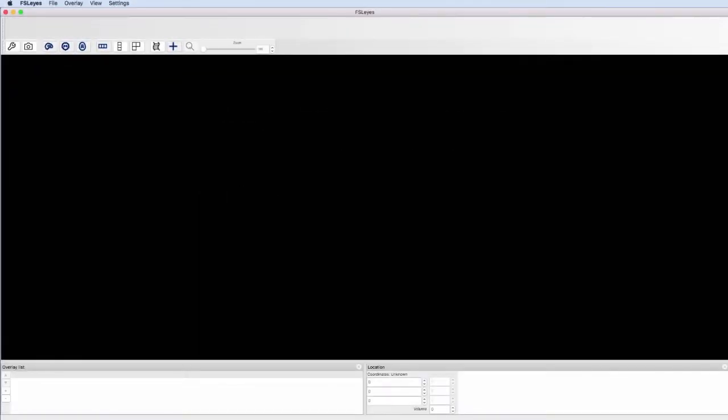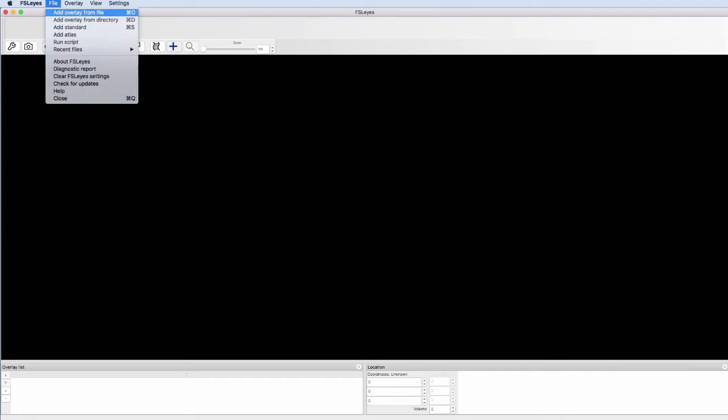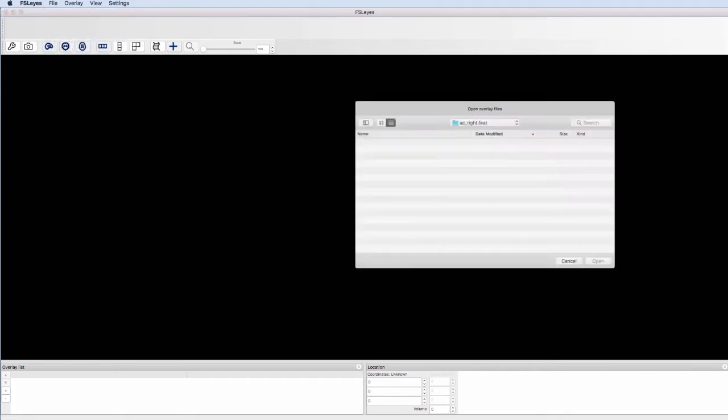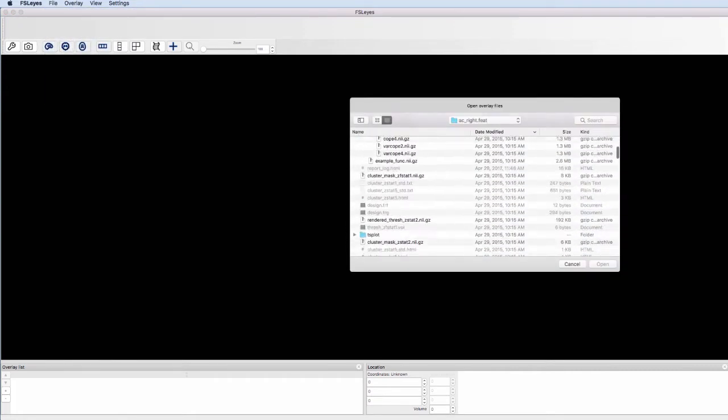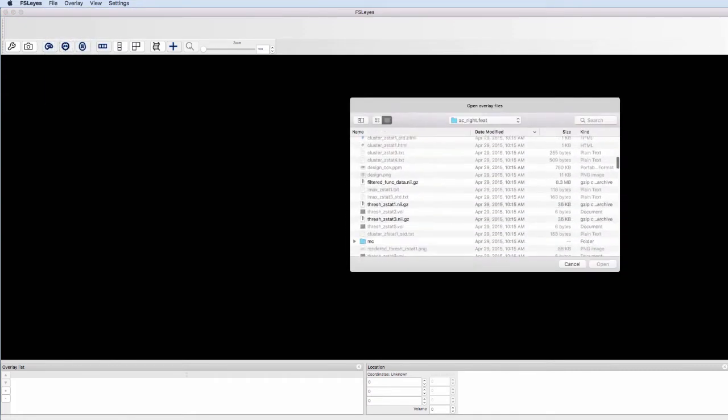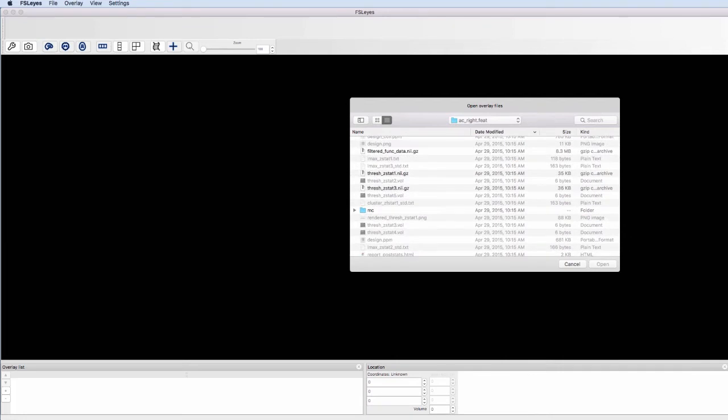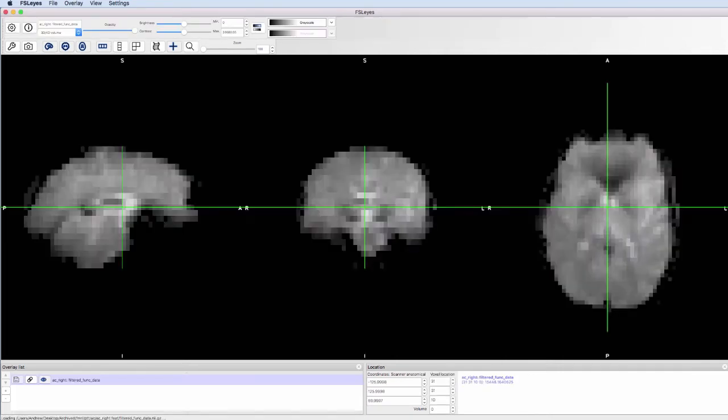You can open up FSL Eyes by typing FSL Eyes at the command line. For this demonstration, we'll be looking at data that's been output into a FEAT directory. Load an image by clicking File, Add Overlay from File, and load the file filteredfunc.nii.gz.